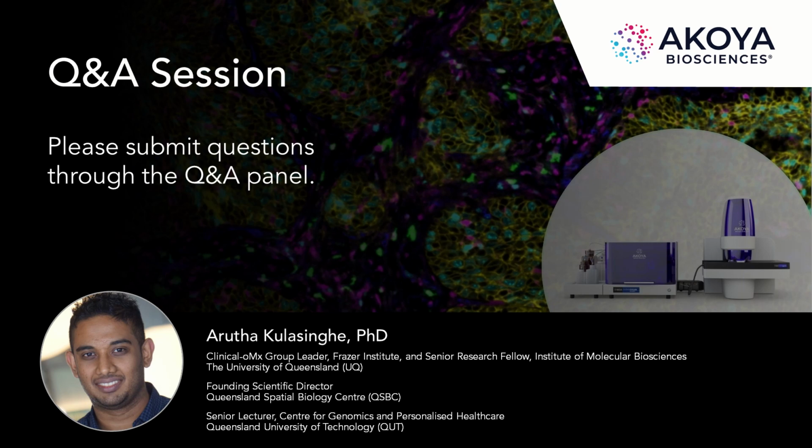I think plexity is part of the story because we're trying to glean as much information as we can from these tissues, but I don't think we're going to be running hundreds and thousands of markers. Yes, potentially for discovery studies, but for the clinical piece, it is going to be a lot less. If we look at the ASCO multiplex IF assays that were published last year, they were all 18-plex or below for clinically linked signatures. So it's telling us that for the clinically linked signatures, we probably need to be between the 6 to 15-plex space. That's probably where we'll end up. So I don't think it's all about plexity.